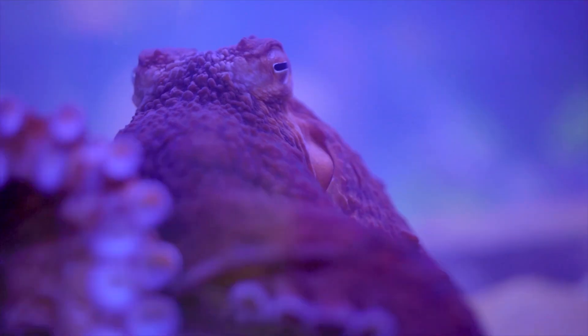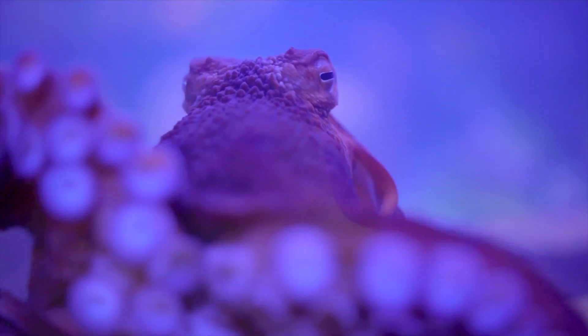Hi, my name is Sam Young. I'm the veterinarian here at the Greensboro Science Center. And today we're taking a look at our giant Pacific octopus. We're doing a full physical exam, ultrasound, and collecting some samples.